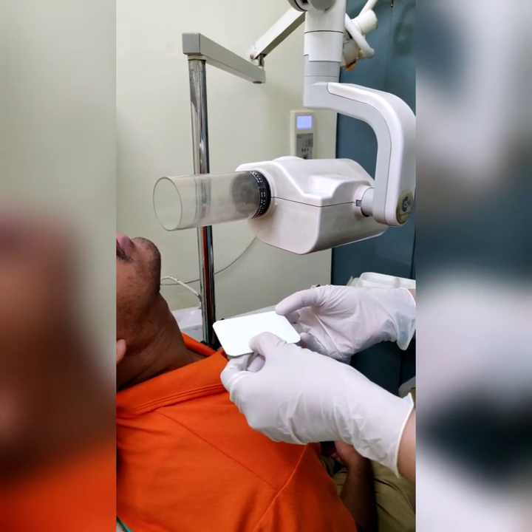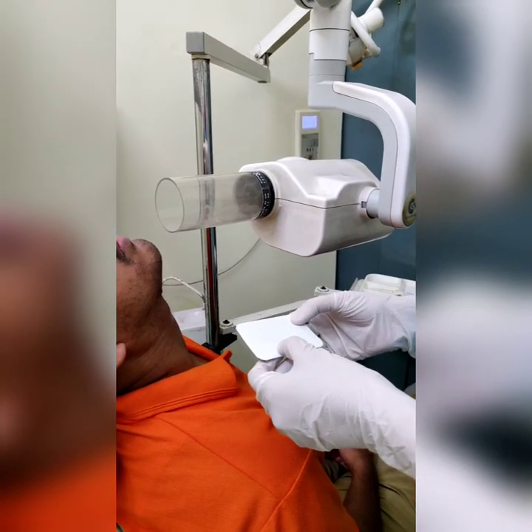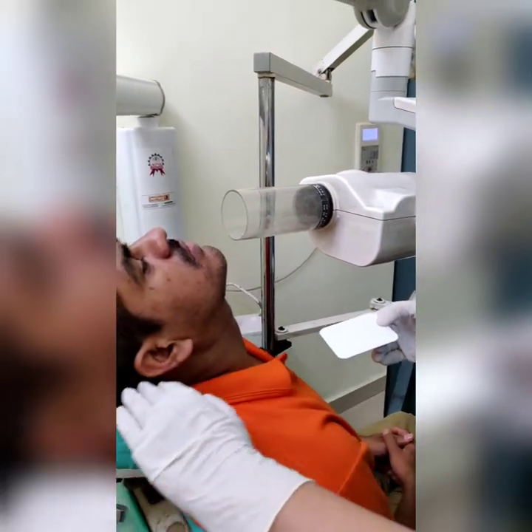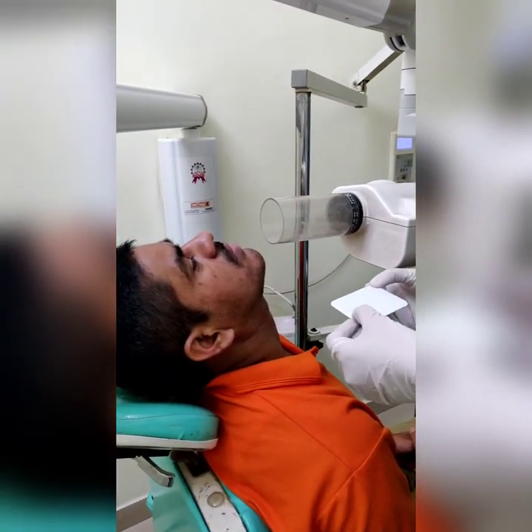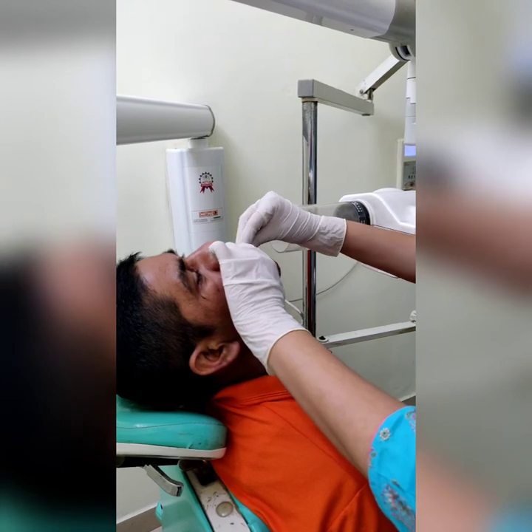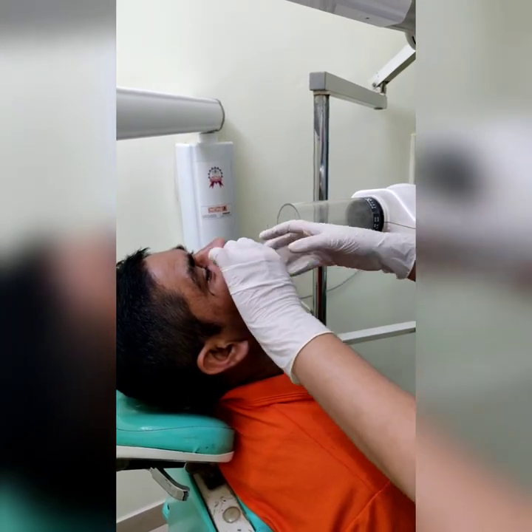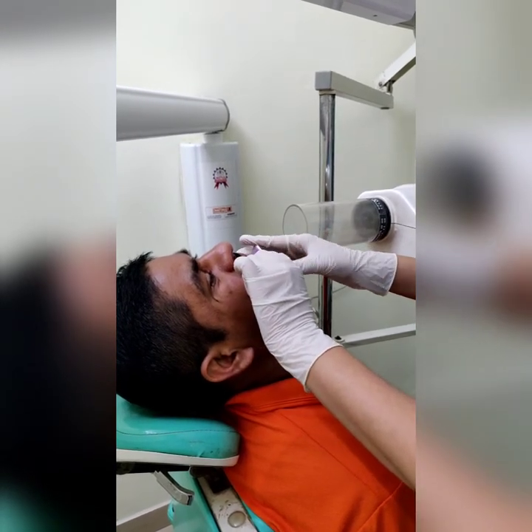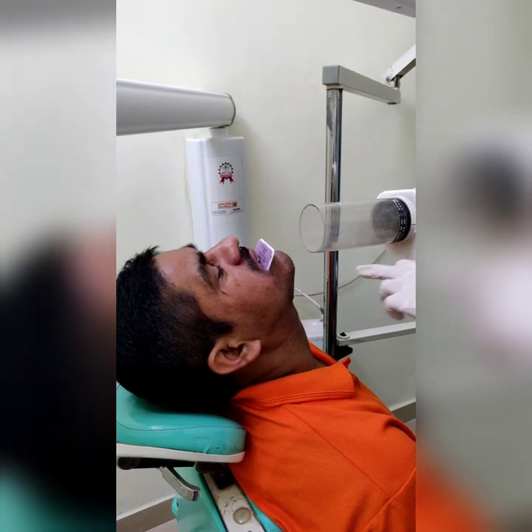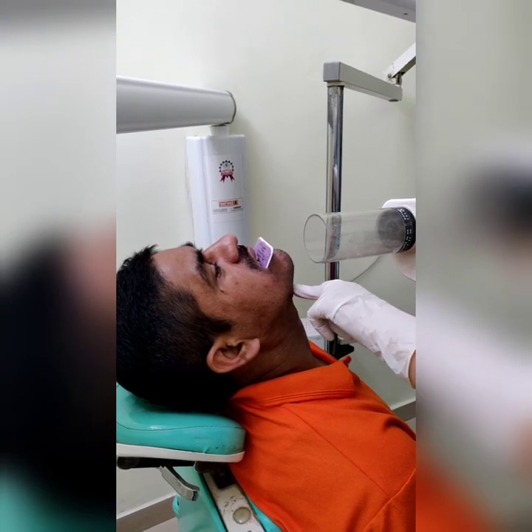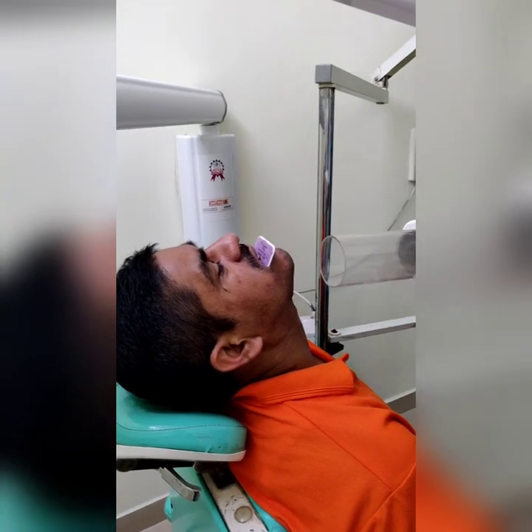Next is the mandibular lingual occlusal radiograph. The patient's position is adjusted so that the ala-tragus line is perpendicular to the floor and the occlusal film is placed with the occlusal dot directed towards the mandible. The film is positioned slightly lateral, approximately 1 cm from the occlusal plane. The patient bites slightly on the film, and the central ray is directed approximately 3 cm below the chin and 3 cm lateral from the midline.